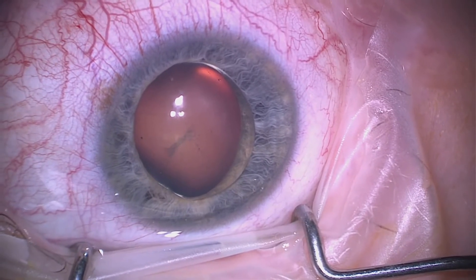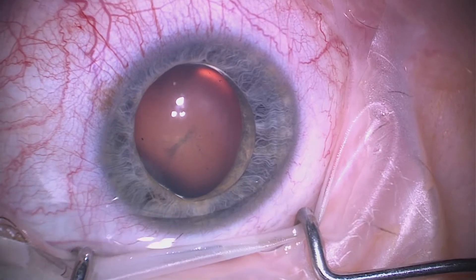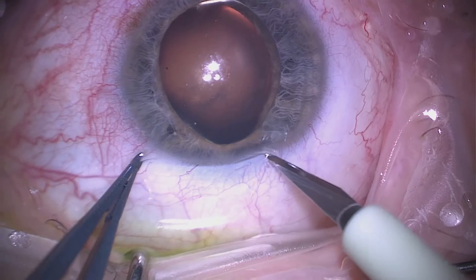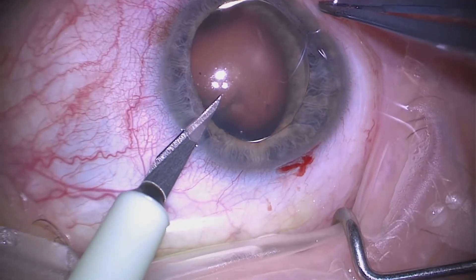This is a patient with Marfan syndrome with a totally dislocated lens into the anterior chamber, referred due to angle closure. We'll start off making some incisions into the eye.